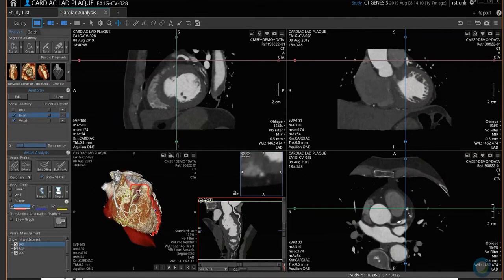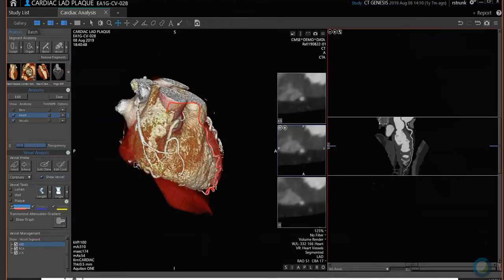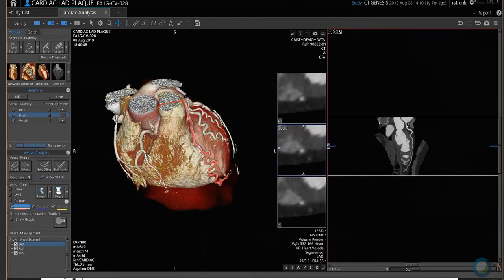If you wanted to see this viewport larger, you just double-click with your left mouse — click, click — and it hides those other views. So now we have your 3D image and your curved reformatted image. With this curved reformat, that means there's a centerline — you can actually see the red line. Back down here, you can see it's LAD. The red line is going down the LAD, and this is what that red line is.